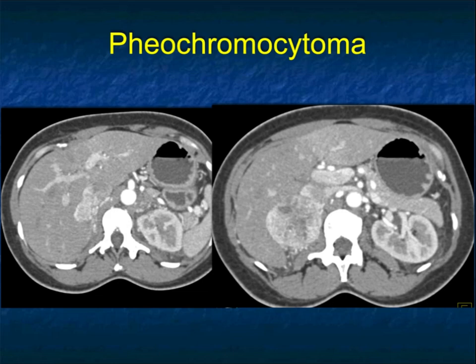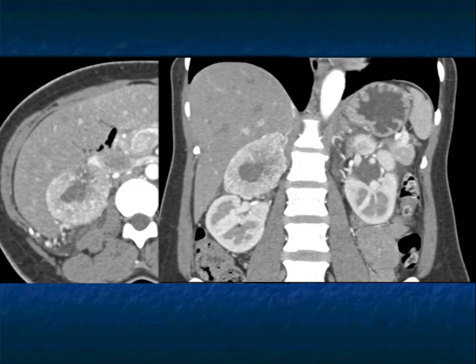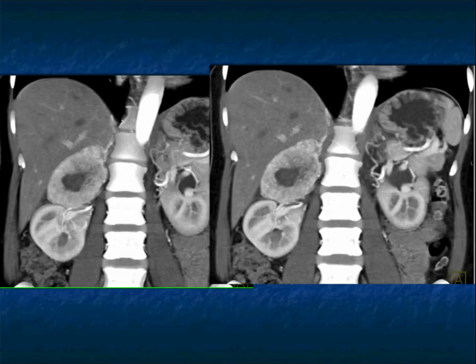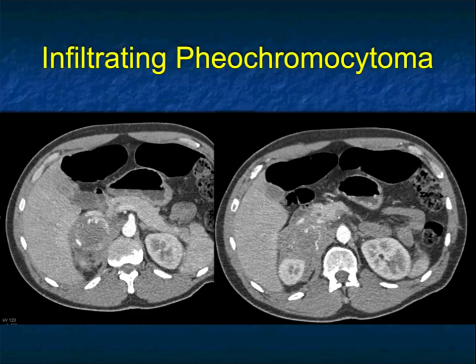Here's another example — a very vascular 7-centimeter pheochromocytoma with central necrosis. Central necrosis is not uncommon. The lesion has prominent vascularity around it. On the image on the left you see the vessels tracking by the right lobe of the liver. The central necrosis, the large solid mass — classic pheochromocytoma.